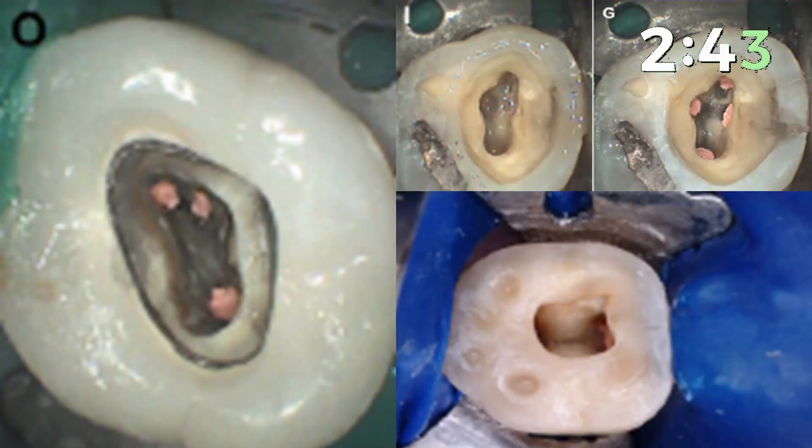In order to avoid that, many other conservative access cavity preparation procedures have been suggested. One such concept which has revolutionized dentistry is the preparation of modern molar access, which stresses upon preparing a very conservative access cavity preparation, thus strengthening the remaining tooth structure.